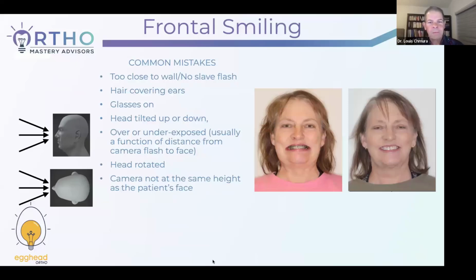If you don't do that, so in fairness, this young lady had just had jaw surgery and had forgotten how to smile, okay, in the left photo. And so I said, all right, we need a smiling picture. That's what she gave me. I said, you know what? Let's have you look in the mirror and see how you smile, okay? So once we debanded, she was able to see again.